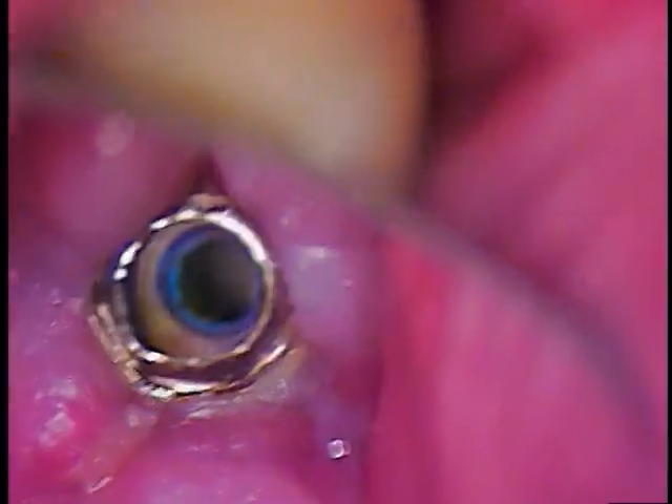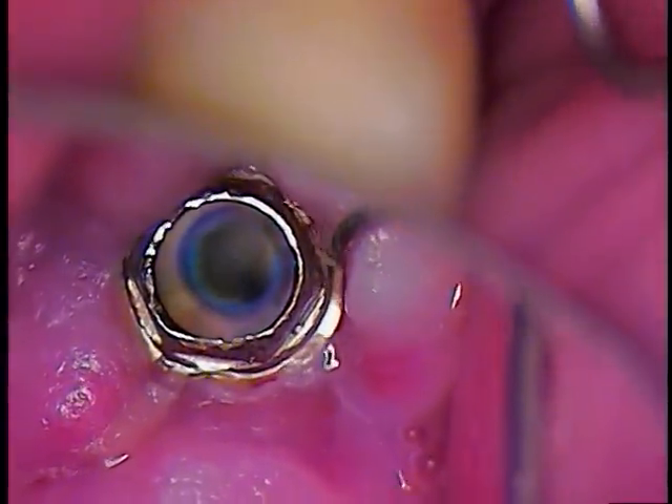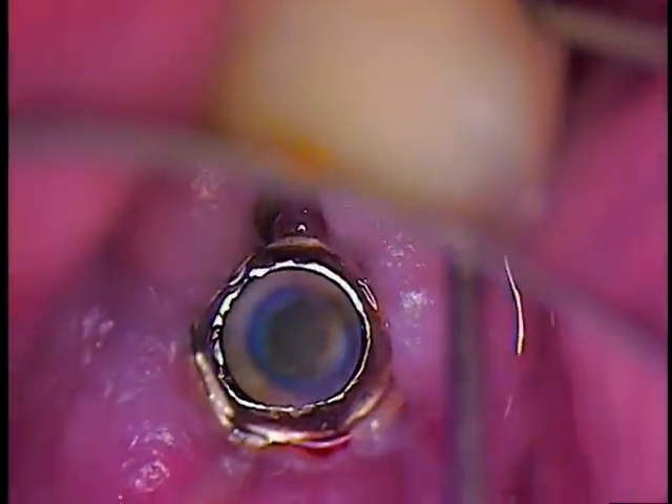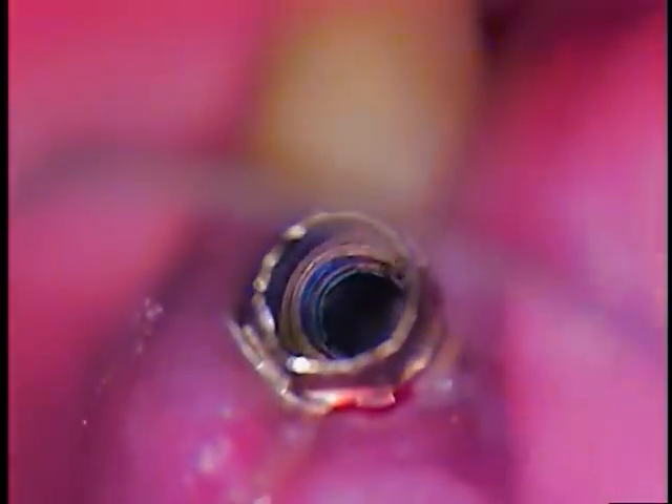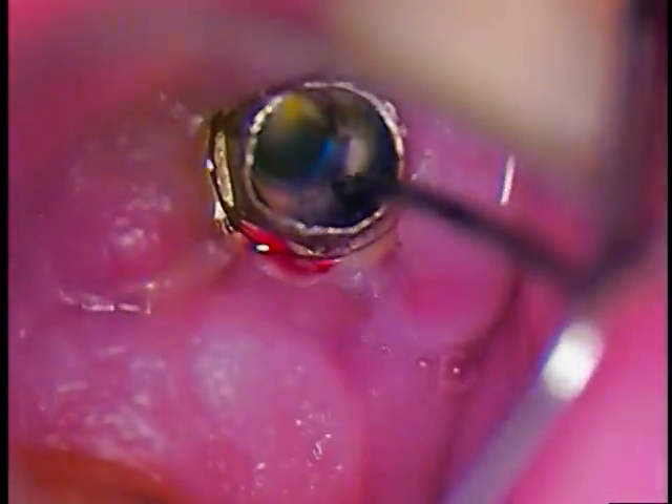I'm going to take a small explorer and just gently move the gum tissue a little bit aside so we can examine that. If I were to measure the extender with a millimeter periodontal probe, I'm looking at about 5 millimeters in length — just about 5 to be exact. The threads are not visible.